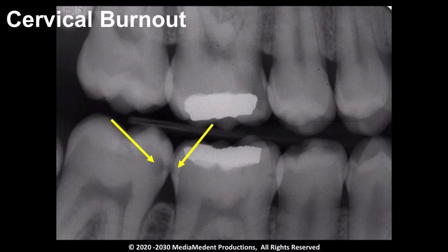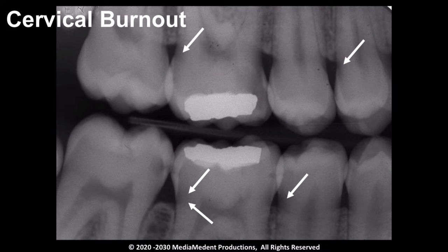This is the picture of proximal dental caries spreading from enamel into dentin. In the cervical region of almost every tooth in this radiograph, there is a diffuse radiolucent area with an ill-defined border. This represents the image of cervical burnout, a normal finding. It does not represent the loss of tooth structure, but is caused by the normal morphology of teeth that allows for a greater quantity of x-rays to pass through the area. In addition, cervical burnout is perceived to be even more evident because of its proximity to the more radiopaque bone-covered root.